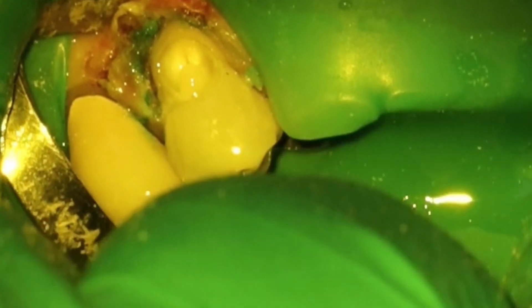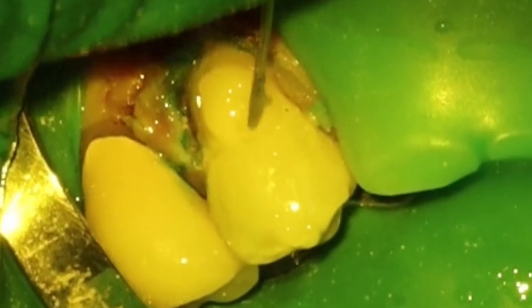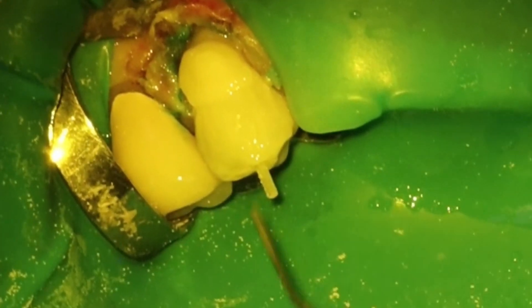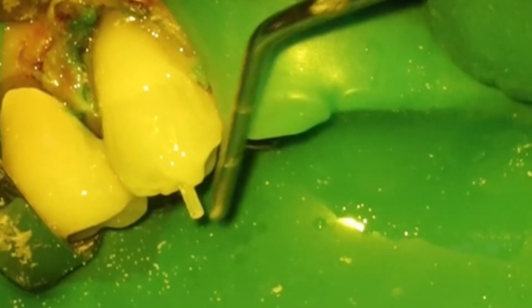With these posts, they're a 0440 — a little bit smaller than the Brassler ones I've used in the past, which are 50s, and they seem to fit these VT shapes a lot better than the larger ones do. I've found I'm using these more and more on really skinny cases. I put it through there — you'll notice I did the occlusal part first, then came back in and cleaned up on the buccal as well. After this, we're going to use the Glick just to help start shaping things. I want to try to minimize how much prep I have to do here, just in general.